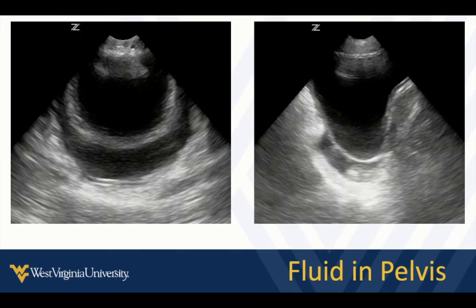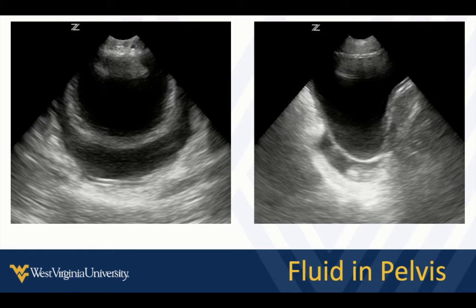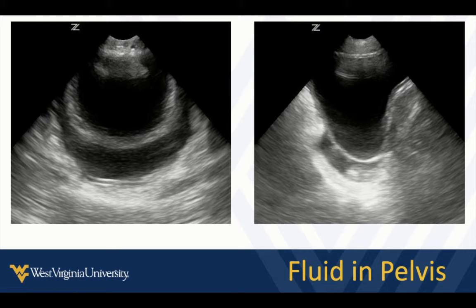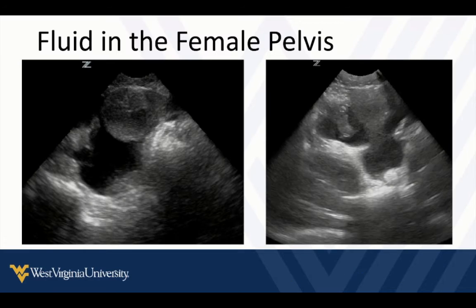If we come down to the pelvis in the male, we're going to see fluid back behind the bladder. Depending on how much fluid there is, it may wrap all the way up and over the top of the bladder, or if it's a smaller amount, it's just going to be behind. Notice it doesn't have that regular forking shape of the seminal vesicles. So that's free fluid there.